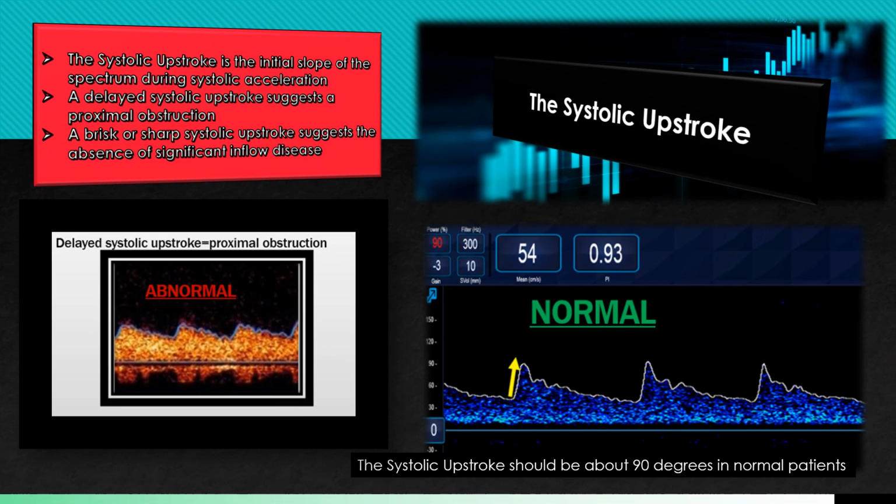The last thing we'll look at on the spectral waveform, along with the mean and the PI, is the systolic upstroke. A systolic upstroke is the initial slope of the velocity spectrum during systolic acceleration. A delayed systolic upstroke indicates proximal obstruction, and a brisk systolic upstroke indicates the absence of any significant inflow disease.